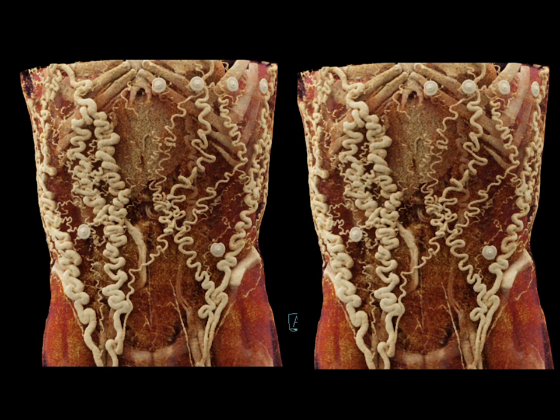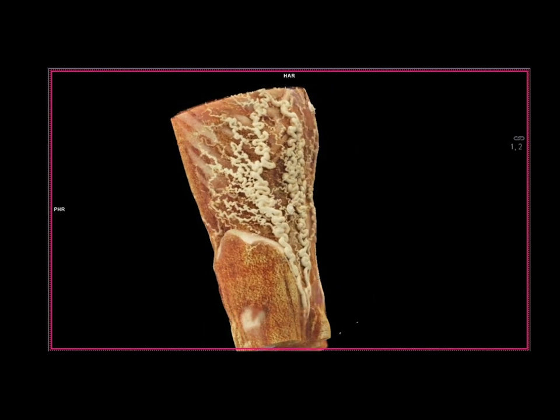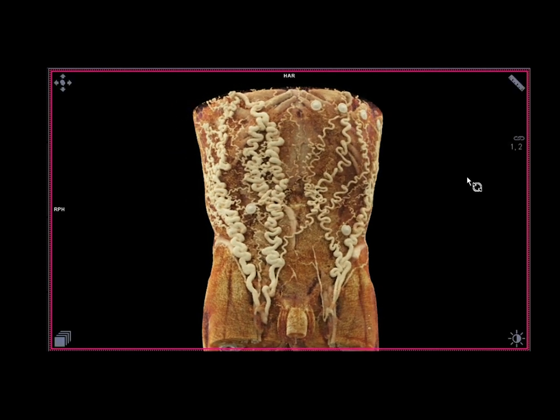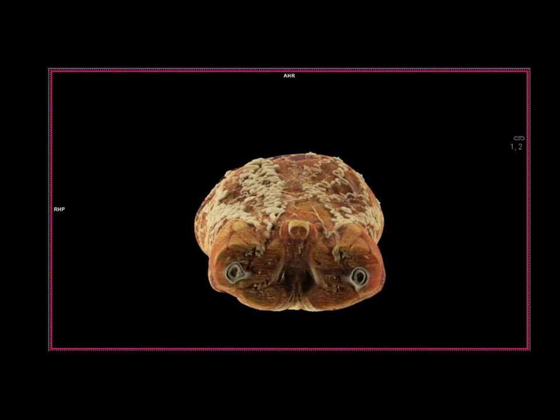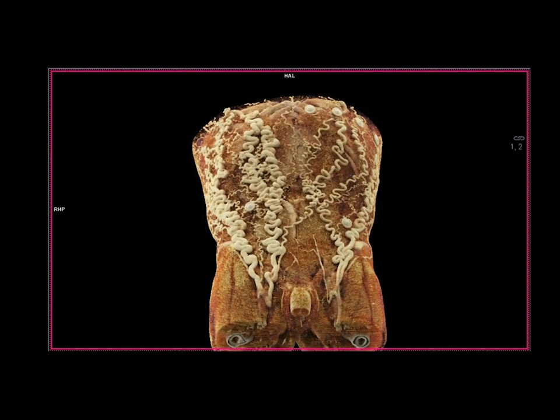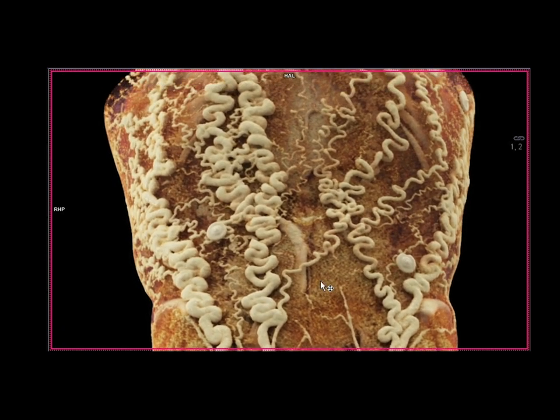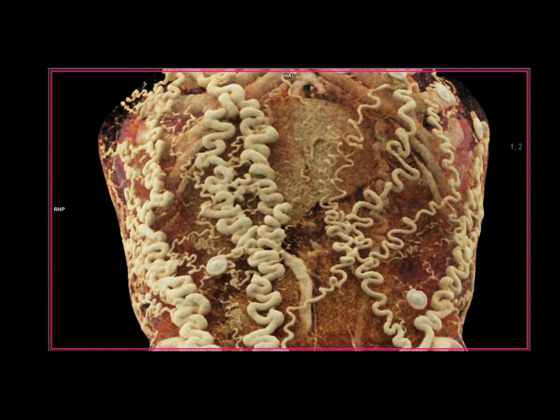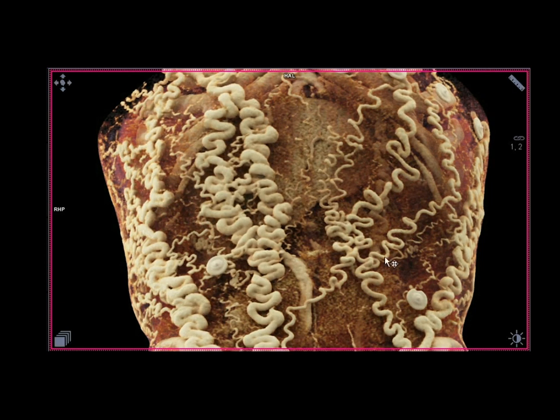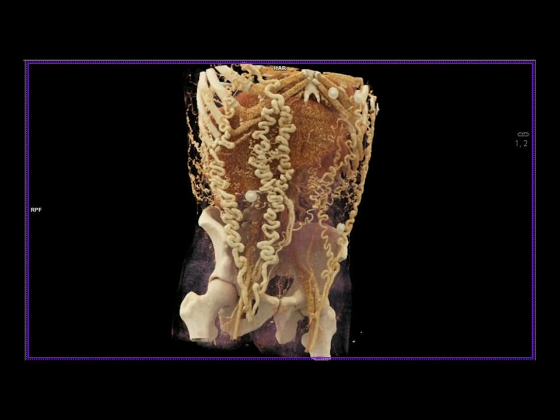Here's a range of different visualizations of that, and then with a 3D map — just simply changing. One of the things we thought about is creating a virtual topogram based on the information — not just showing lines through a patient or the ribs or the pelvis or the spine, but showing the outer side of the patient, which can be very important. There's so much information on the skin that we often do not use. As I rotate these images around, you can see why that can prove to be very valuable. Here I've made the bone more opaque, made the muscle transparent, and I'm showing you the collaterals.